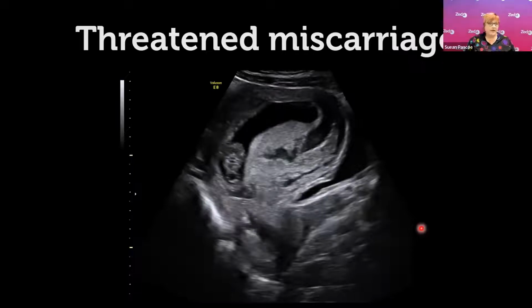The other thing that might be happening, and happens quite often, is that they can have pain and bleeding and they can be threatening to miscarry, and we can see perigestational bleed, but we aren't crystal ball gazing and we can't necessarily say that definitely it will miscarry. All we can do is comment on the day what we've seen. And so in this example, we have the vaginal stripe here, an anteverted uterus with the gestational sac. And the crown rump length there is probably about the 8 to 9 week mark.